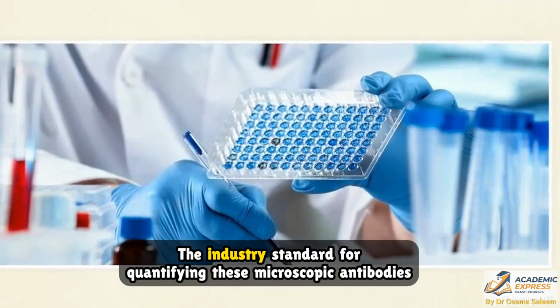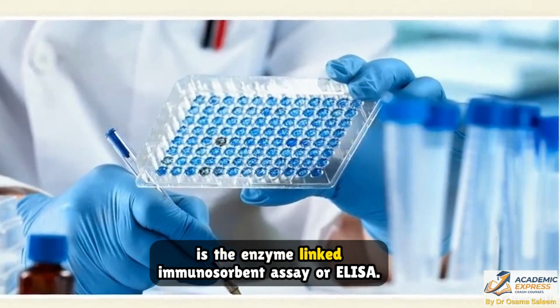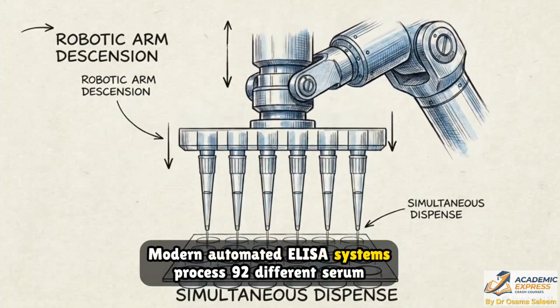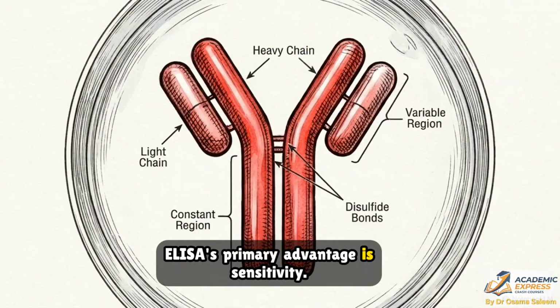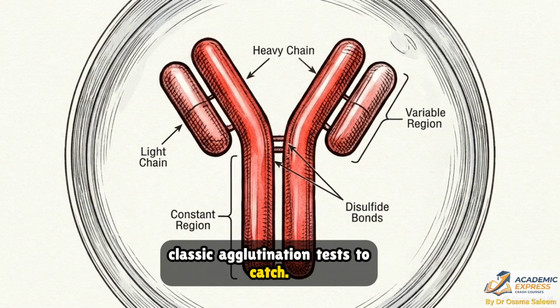The industry standard for quantifying these microscopic antibodies is the enzyme-linked immunosorbent assay, or ELISA. It is built for volume. Modern automated ELISA systems process 92 different serum samples in approximately 2 hours. ELISA's primary advantage is sensitivity. It detects antibody concentrations far too low for classic agglutination tests to catch.